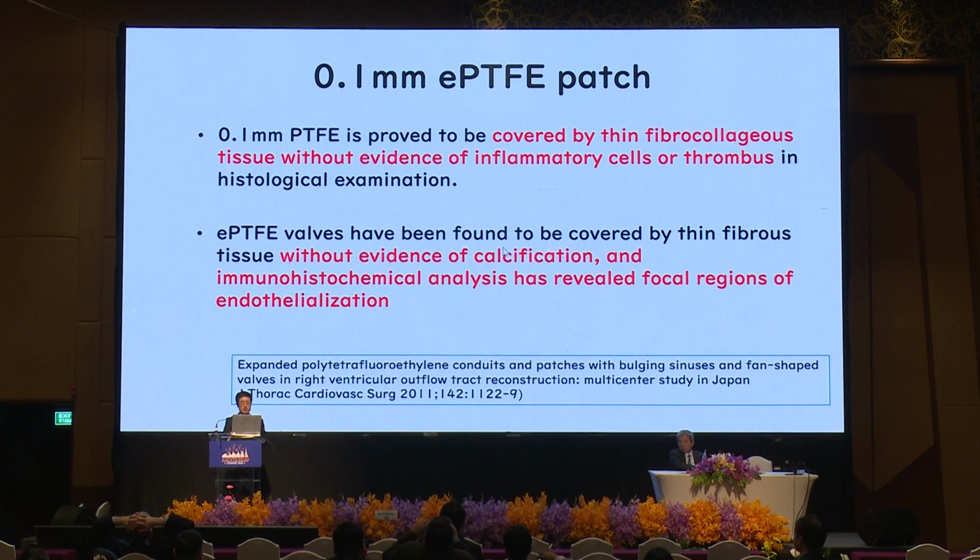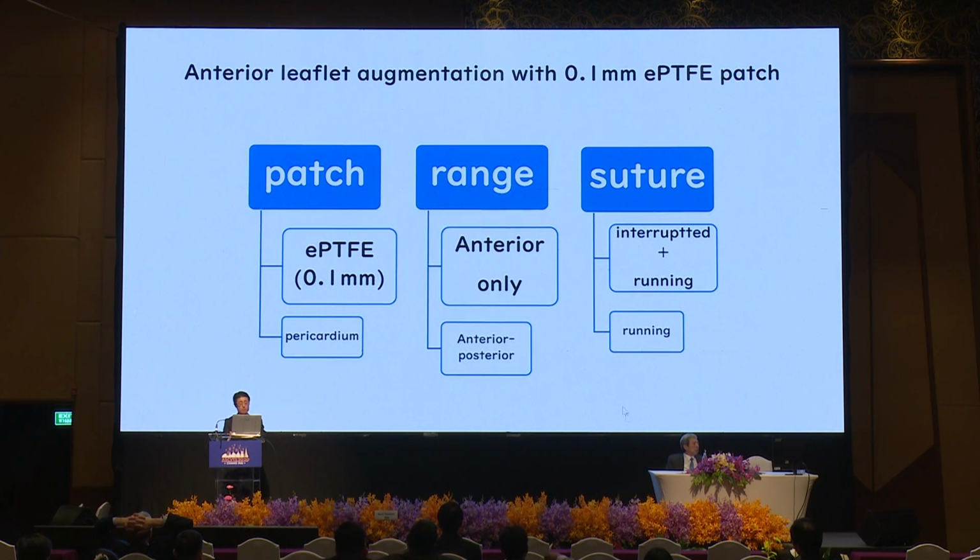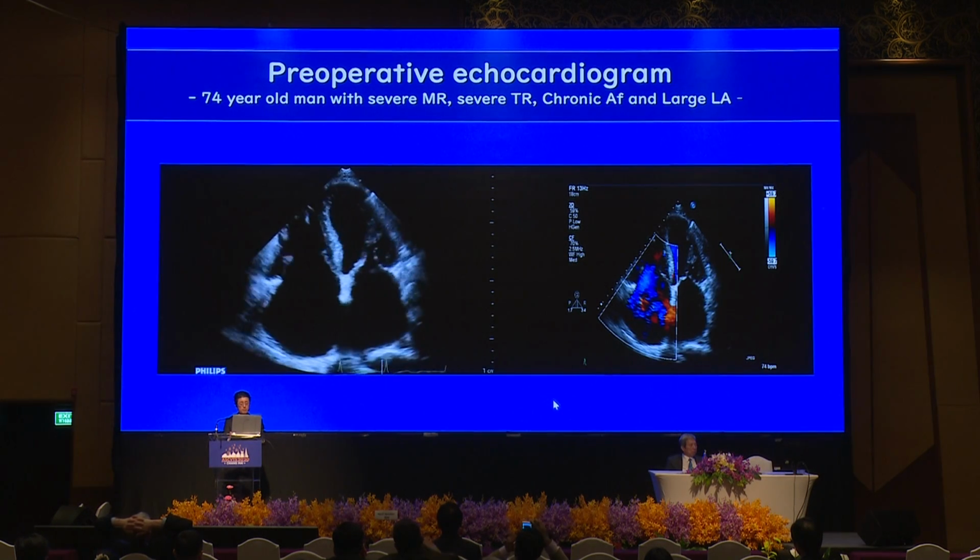Immunohistological analysis has revealed focal regions of endothelialization. So I decided to use the 0.1 millimeter ePTFE patch and enlarge the anterior leaflet only, and the suture was interrupted and running.